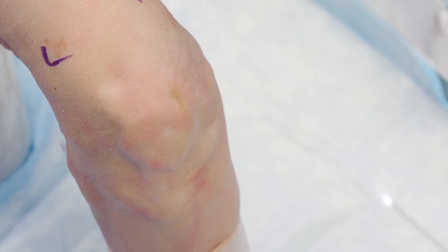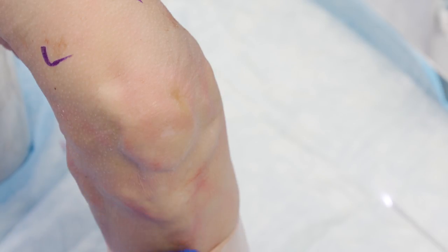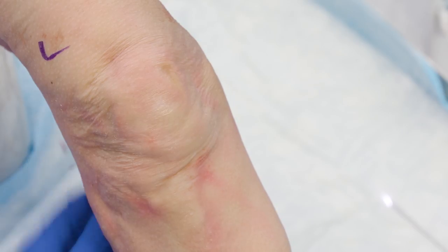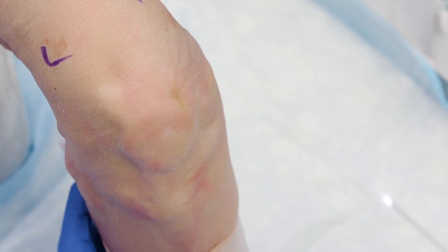When looking at my patient in the office, I want to get them comfortable. The two most common ways to position patients are either with the leg off the end of the bed flexed to a 90-degree position, or lying down at 45 degrees with a gel bump underneath the knee. For this demonstration, we'll use the knee in the 90-degree position.